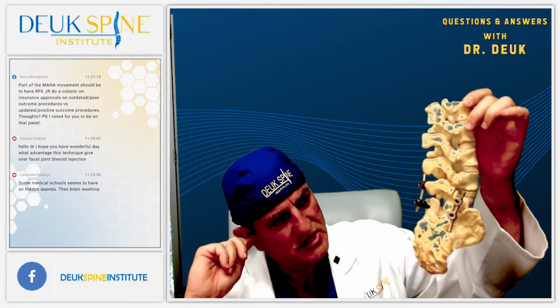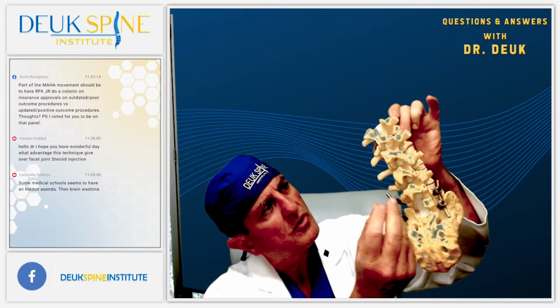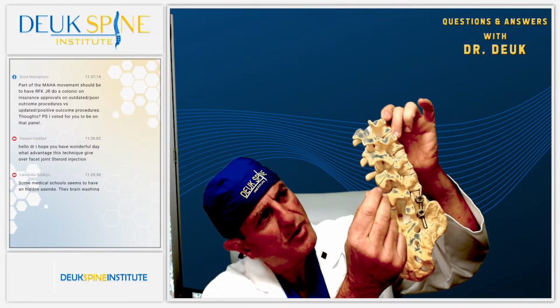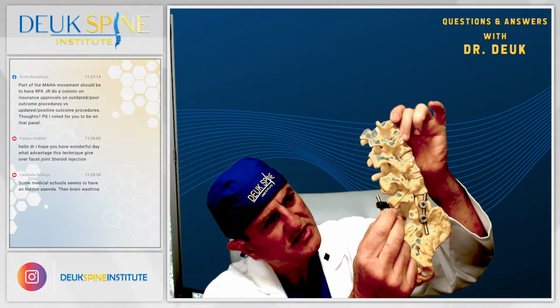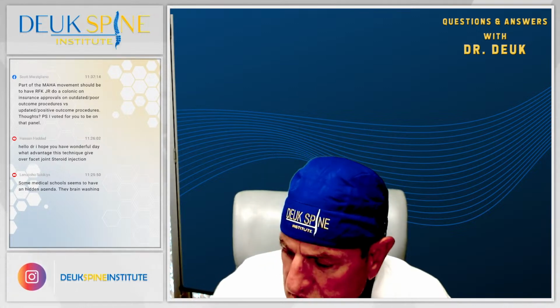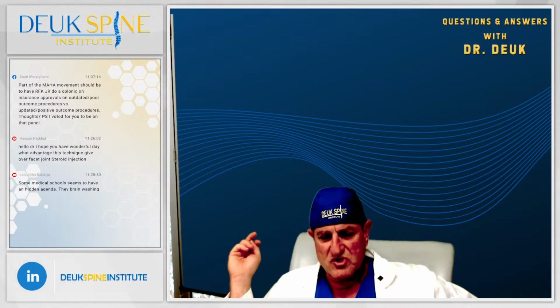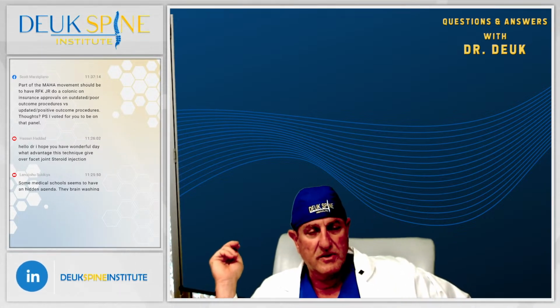Then we treated the facet joints. To do that, you go where this transverse process meets the superior facet right in that corner, and we burn the pain nerve right there. Okay, so that's what I did. We did 2 procedures. We had 2 streams. This stream right now that you're watching is the facet joint because we finished the disc earlier.